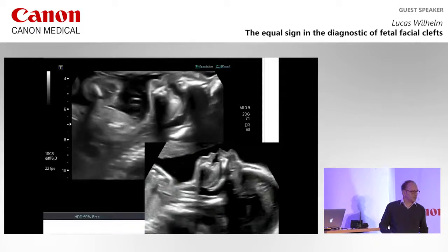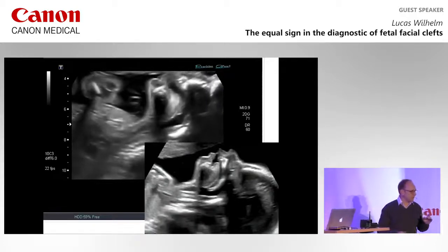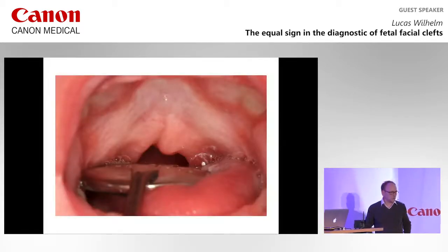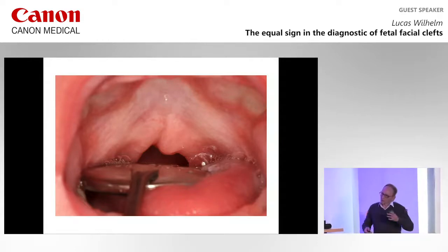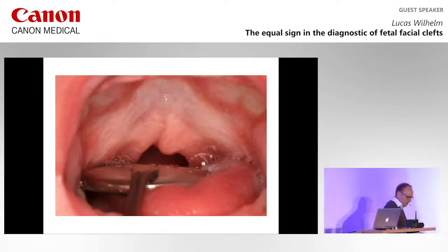Okay? So in this case, we made a diagnosis of an isolated cleft palate only of the soft palate. Okay? And you see here the picture postpartum. Okay? So you see, you can detect isolated cleft palate only in the soft palate too.